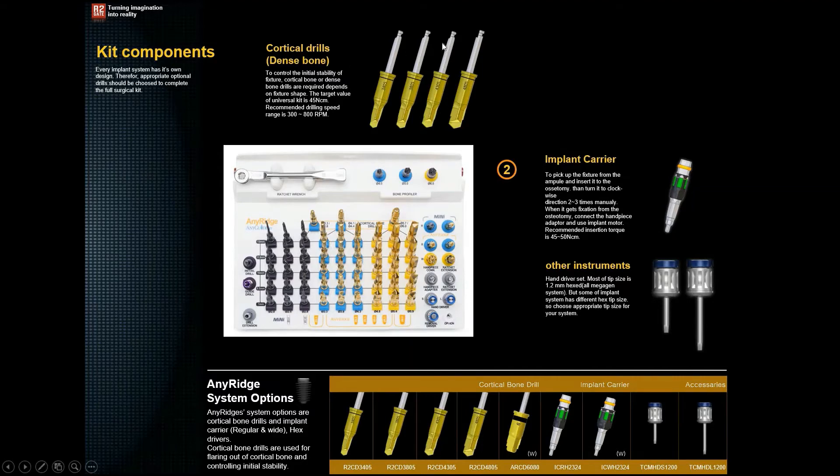There are also cortical bone drills, which remove the cortical bone. Their names follow a format such as 3405 or 3805 — the first two digits indicate the diameter and the last two indicate the length in millimeters. For example, a 3805 drill has a diameter of 3.8 mm and a length of 5 mm. Please note that all cortical bone drills are only 5 millimeters in length.